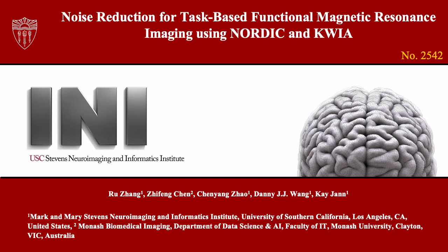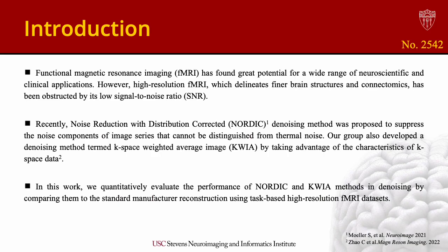In this presentation, I am going to discuss noise reduction for task-based functional MRI using NORDIC and KWIA. Functional MRI has found great potential for a wide range of neuroscientific and clinical applications. However, high-resolution fMRI, which delineates finer brain structures and connectomics, has been obstructed by its low signal-to-noise ratio.